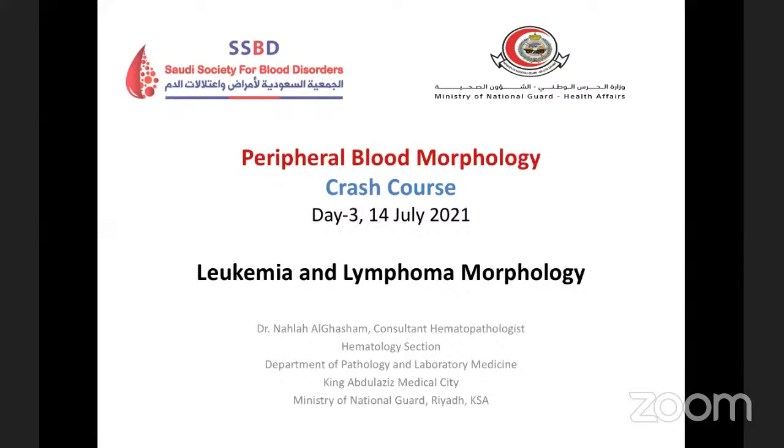But I chose 17 cases that we will go through. They will cover some leukemia and lymphoma diseases that may have peripheral blood morphology findings, which may help pathologists, technologists, and interested clinical fellows who would like to share in the diagnosis of the peripheral blood.